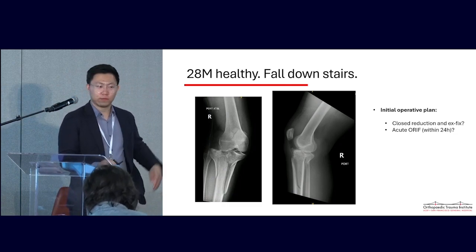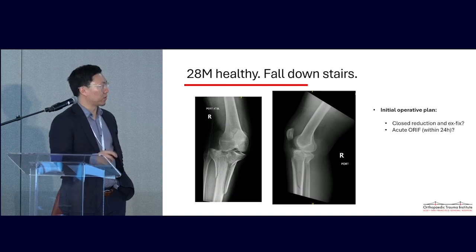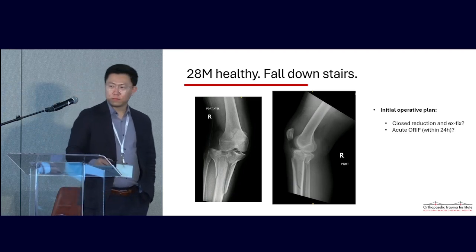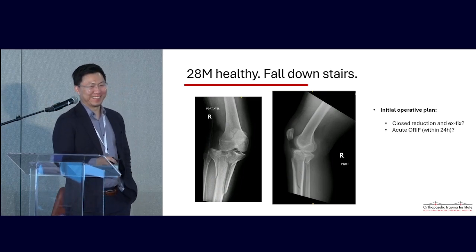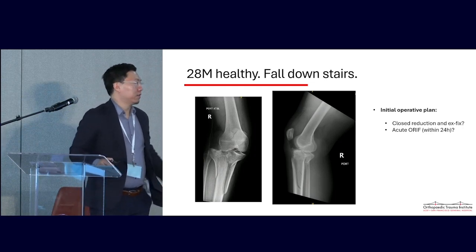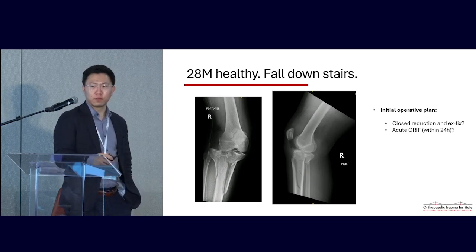Okay, so 28, drugs, anything bad, you just fell? Nothing significant. All right, so comminuted, high-grade, intra-articular fracture, healthy guy. Nothing else wrong? No. What's the rest of the tibia look like? Rest is fine. The patella looks like a fracture. I think that ended up being more of a subacute or insignificant finding.